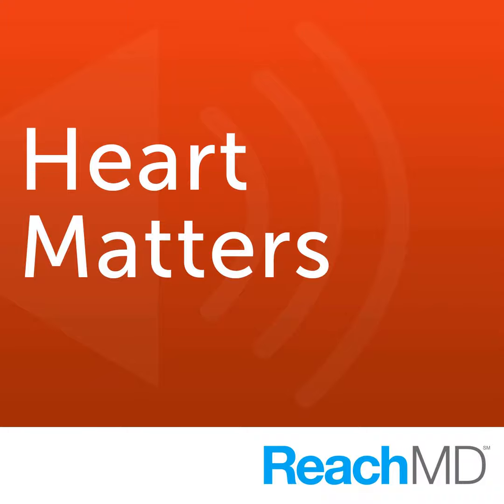So we haven't taken the physician out of the loop in any way, shape, or form. The physician is integral to the procedure. And so while the physician has their hands on the catheter and manipulating the catheter, we can see those catheter movements in real time in that three-dimensional hologram. Now, I also want to add that this was an important part of the usability of our system.